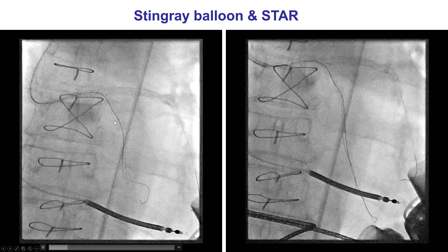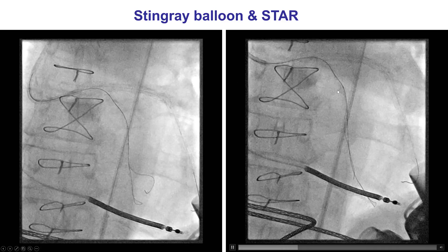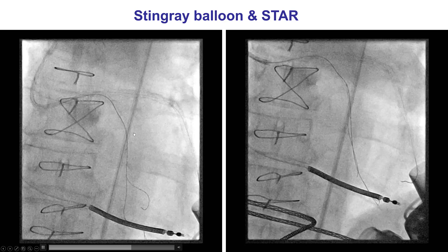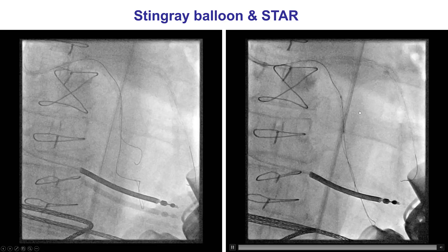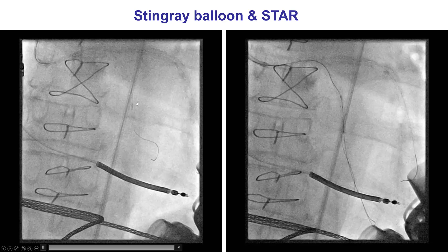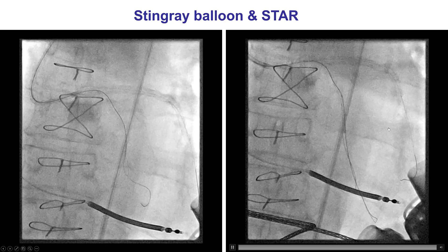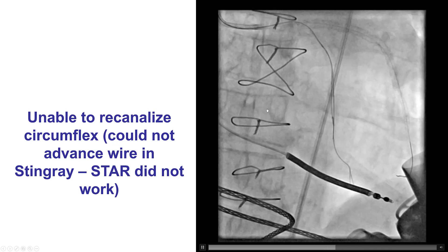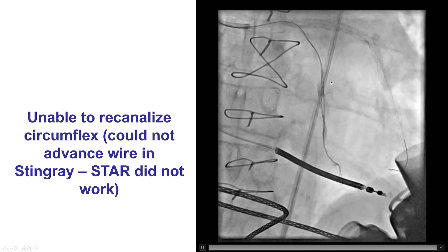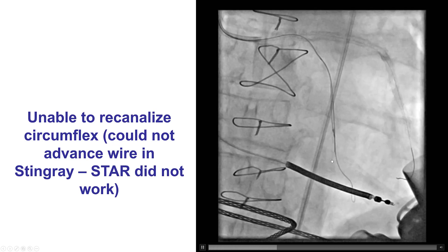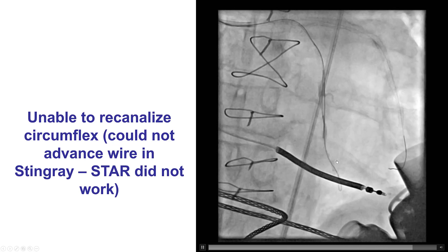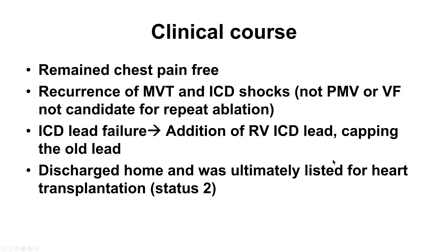This was challenging. How can we re-enter into the distal true lumen? We tried workhorse wires but it was not successful. We then tried a stingray balloon to try to re-enter, but that was also not successful. In the end, we could not get equipment to go through. We tried the STAR technique with a polymer-jacketed wire but did not really get much flow.